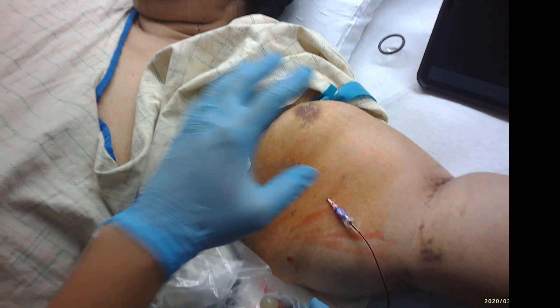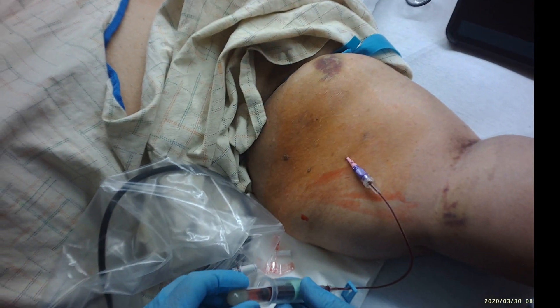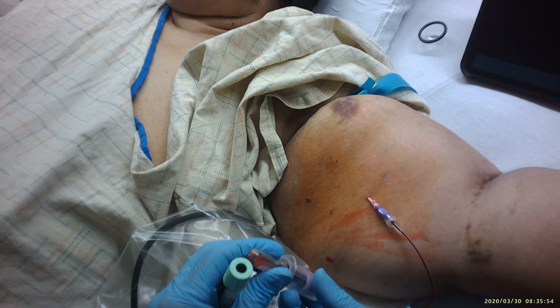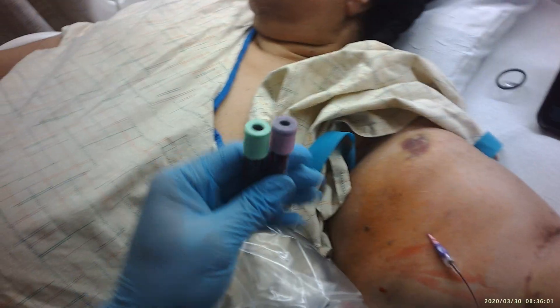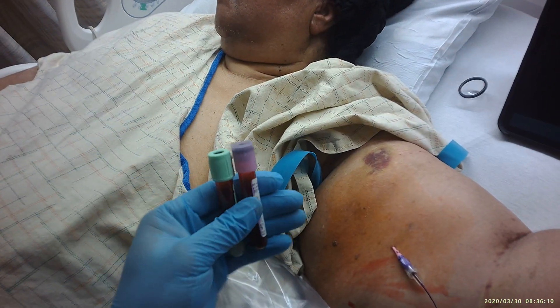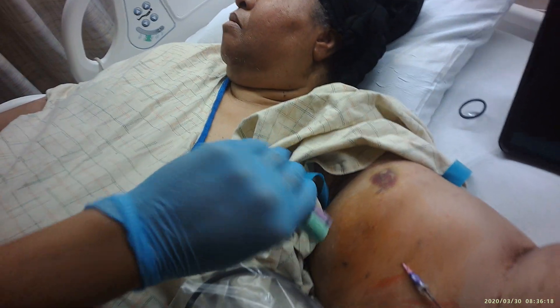Why did I take the luer lock off? Because I'm an idiot. But luckily I'm not here to place an IV — I'm just using the IV to draw the blood because her vein was so deep under the skin. Someone suggested that I start upside down, especially if I'm afraid that the downward pressure of the blood hitting the bottom of the tubing may hemolyze the blood. You're going to gently roll the blood — think of your RBCs as crystal orbs. Some of them are very fragile. The more you shake it up, the more trauma you cause to the blood itself, and we're going to hemolyze more of it, making the sample unusable.